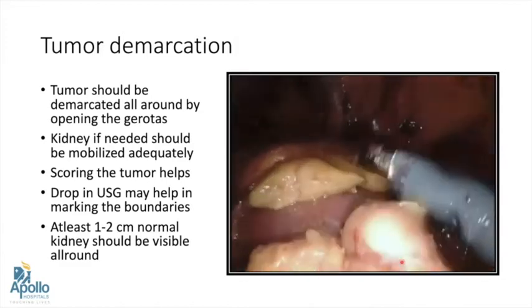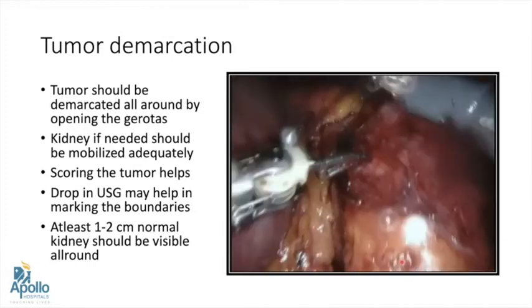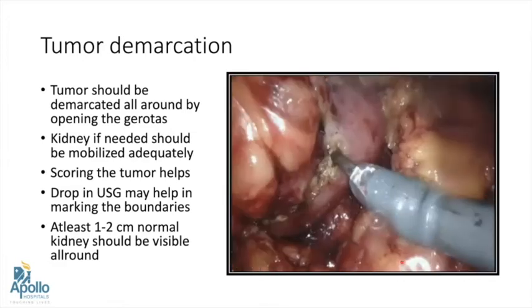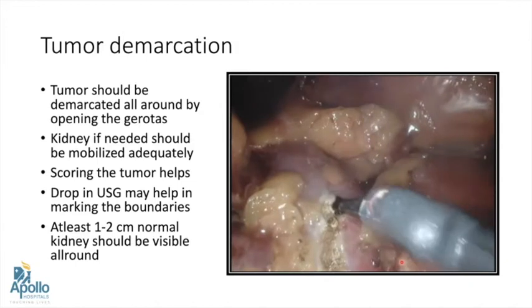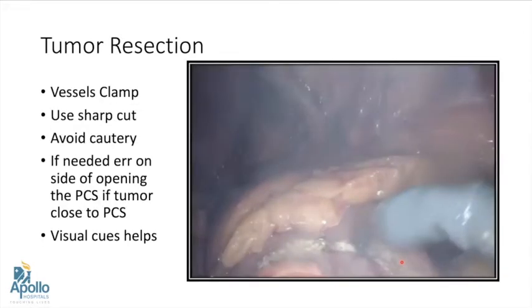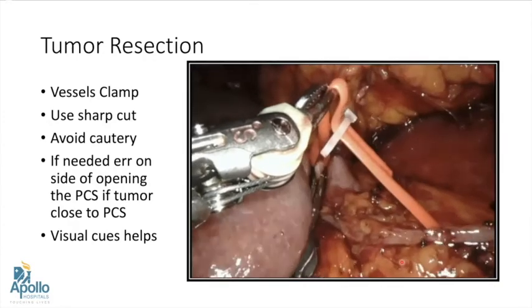We should see normal parenchyma all around the tumor for 1–2 cm. Drop-in ultrasound is very useful, especially for endophytic tumors. Scoring or marking the tumor serves two purposes: it tells us if we have dissected all around and gives us confidence, and it provides a margin from which we can proceed. The kidney should be completely mobilized depending on the position of the tumor.